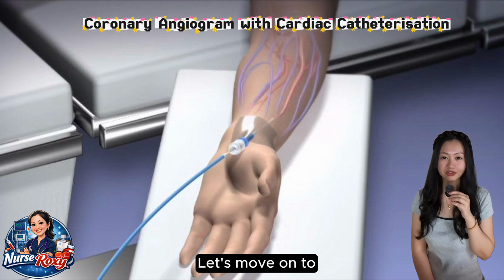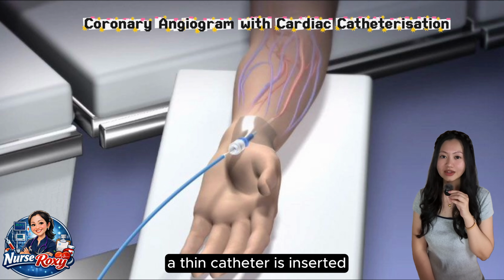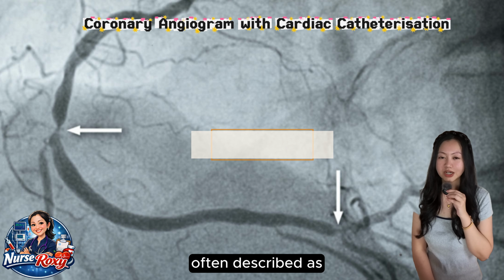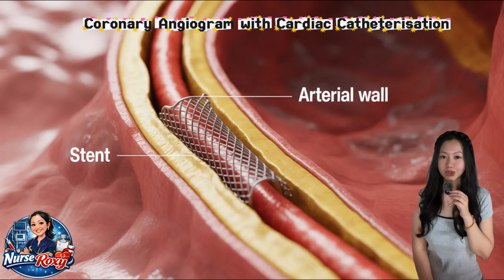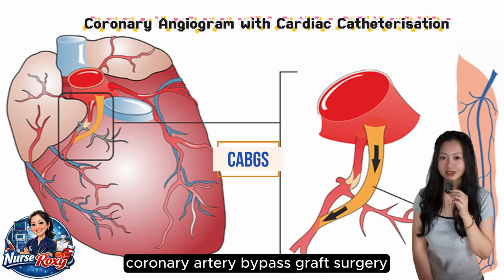Let's move on to coronary angiogram with cardiac catheterization. In this procedure, a thin catheter is inserted through your wrist or groin and guided to the heart. After contrast dye is injected, cardiologists can clearly visualize how narrow the arteries are, often described as percentage of stenosis. For example, you might hear 50% of stenosis in LAD. If necessary, a stent can be inserted to open the artery, but if the stenosis is severe, the patient may be referred to have coronary artery bypass graft surgery.